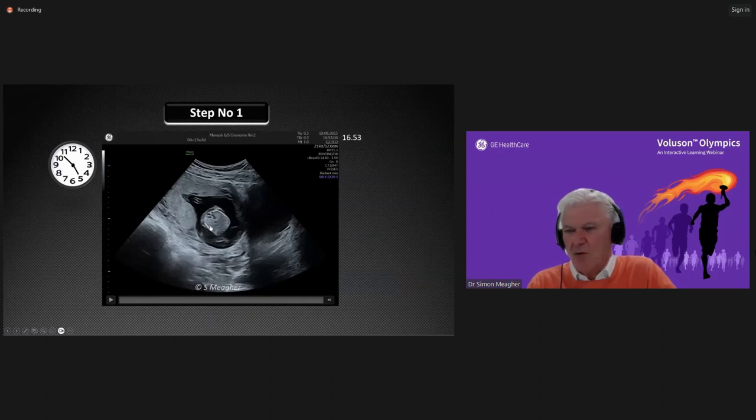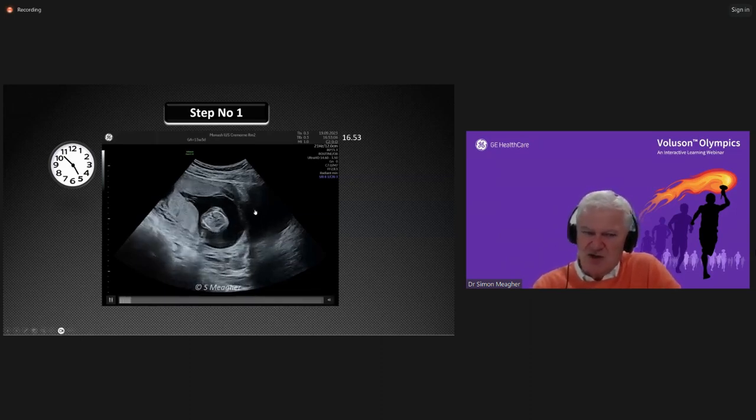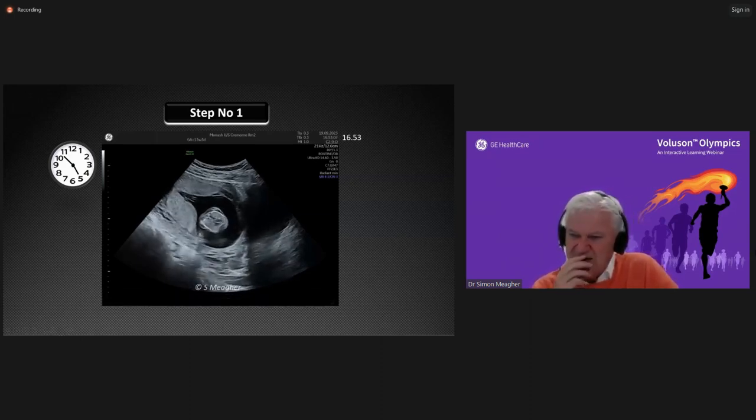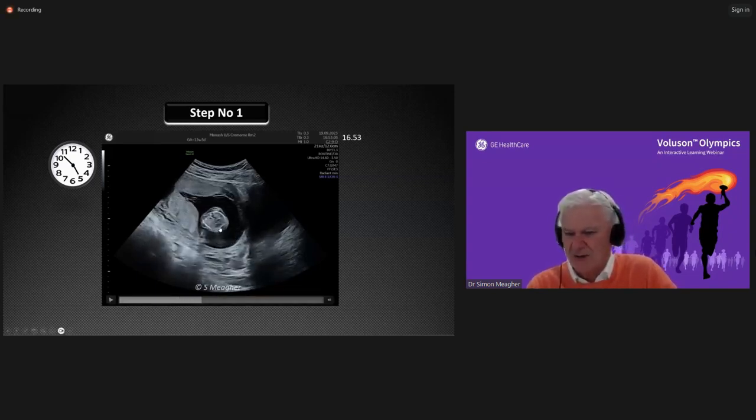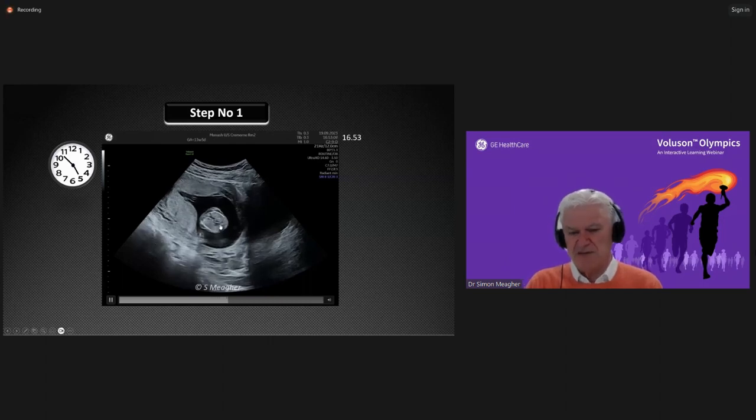Now, I'm going to walk you through a case which we saw very recently, by way of example of stepping into a room with me tomorrow morning. If you were in the room with me tomorrow morning and I showed you this image at 10 to 5, as we were just about to leave the practice, you would say to me, Simon, that's a shocking image you're showing me. I would absolutely agree with you. I can barely see the heart present, but I can see there's a pulsation. I can see it's alive.